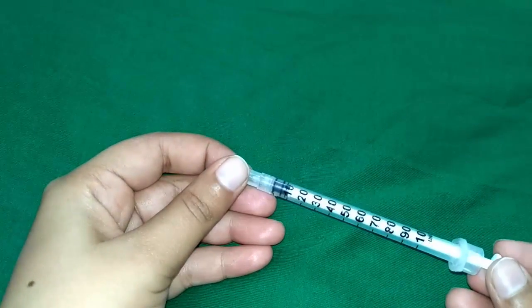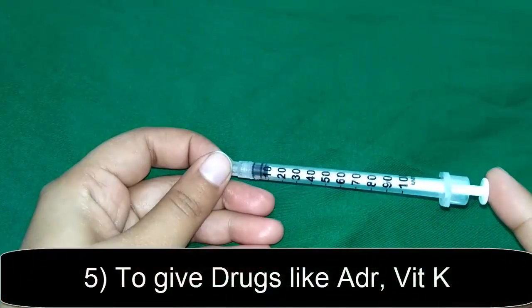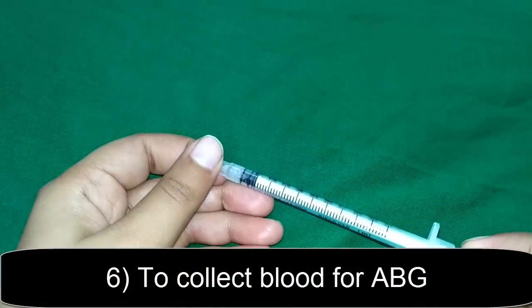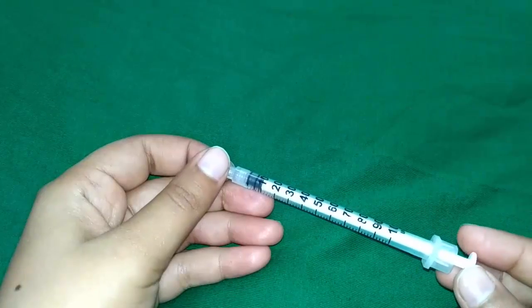It is also used to give injectable drugs, for example, injectable adrenalin 0.5 to 1 ml and vitamin K 0.1 ml in a newborn. It is also used to collect blood for arterial blood gas analysis. This completes the video on insulin syringe.